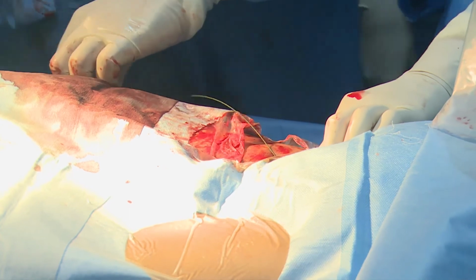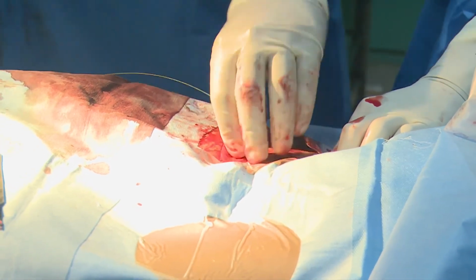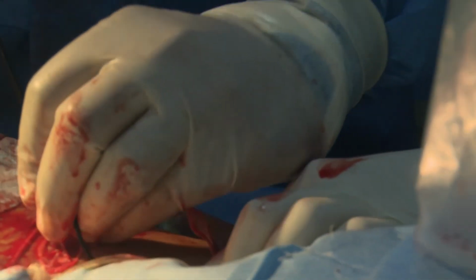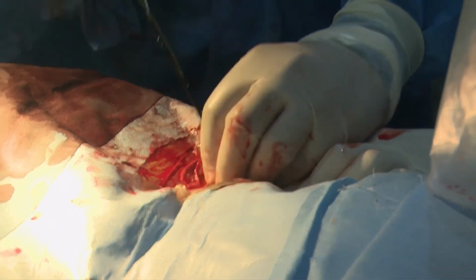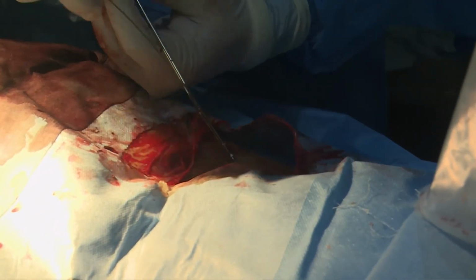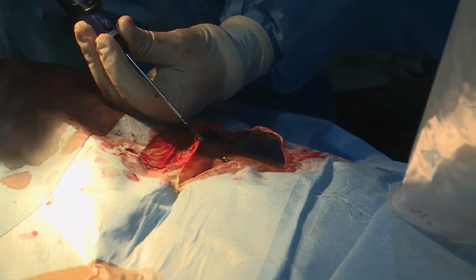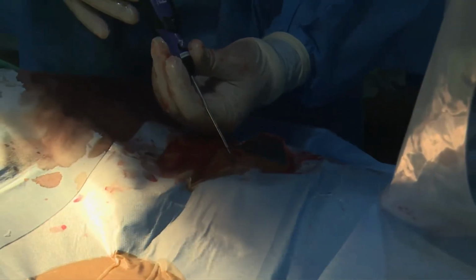Now we will take that, just press it. So there are 2-3 important points. It has to be long wire, not a short wire, and the track should be properly dilated, otherwise your knot pusher will not go. This is very sophisticated, it will go. Now you see here the wire port, exit wire port. Now we remove that wire and we go in.